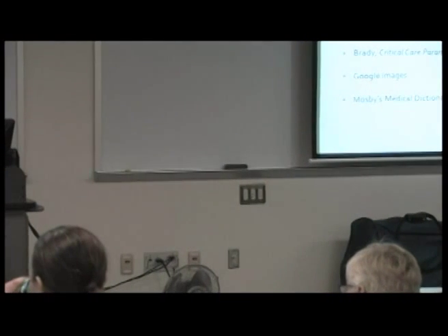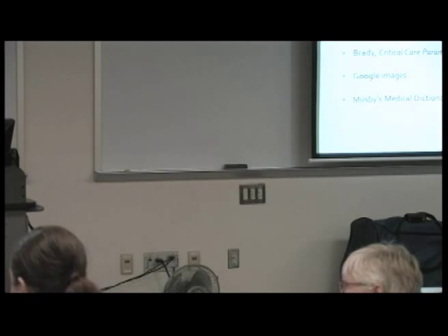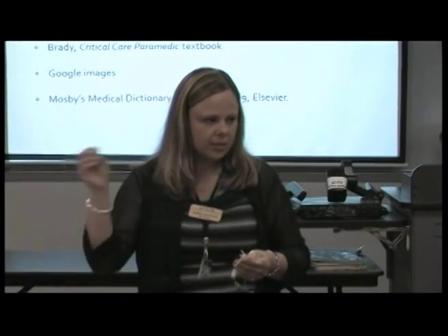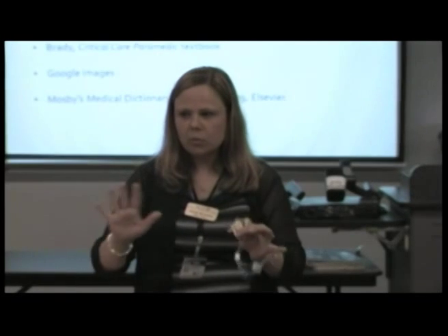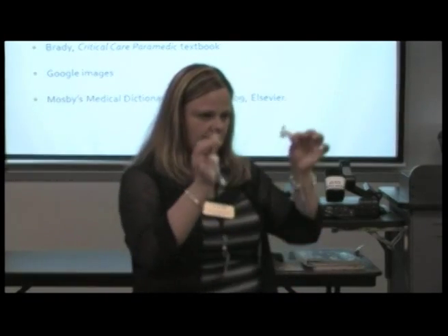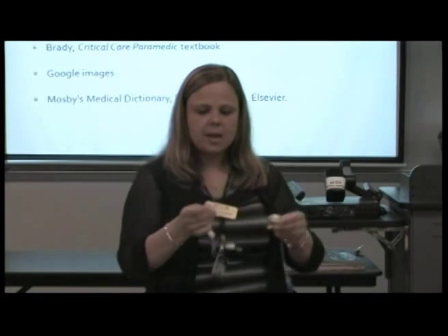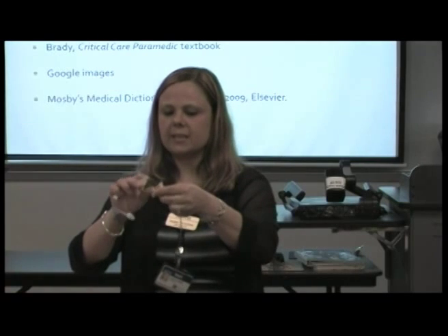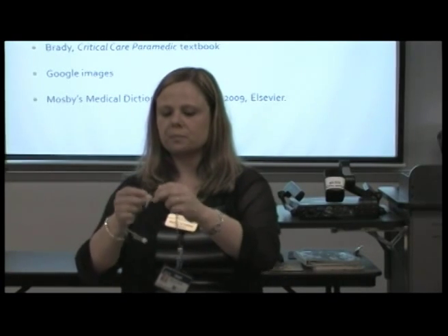Yep, so on our Huber needles, I think you'll see a lot more power ports. In the ambulance these can be accessed with this, but if the patient gets to the hospital and they need a CAT scan, they'll have to do the power port one. We're going to use what our department has. If our department says we're not going to access the power ports, these have to be used to access the power ports, and there's a little bit of a difference in the needle size that you'll see when we put our hands on. One's a little bit longer than the other.